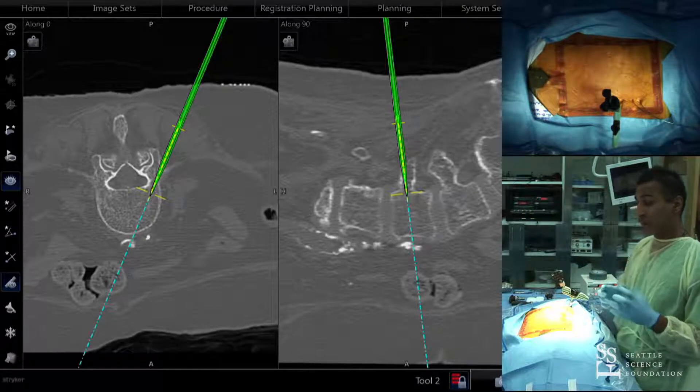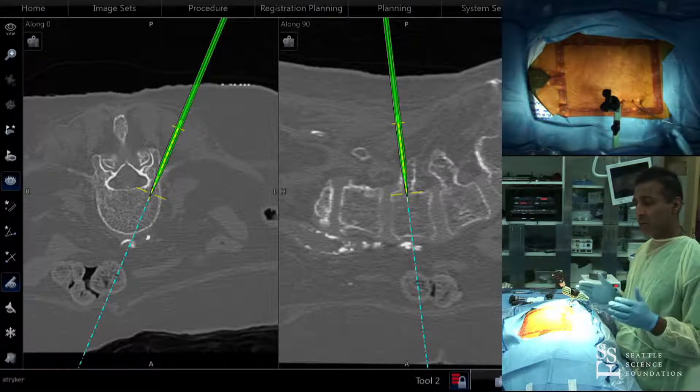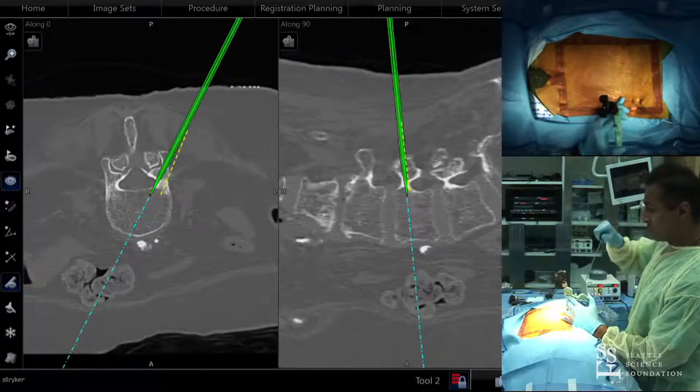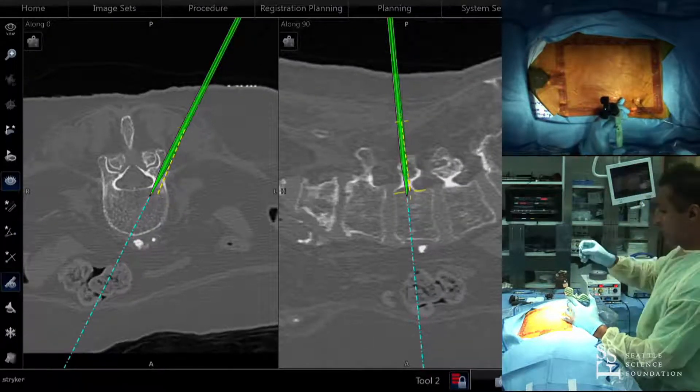I don't worry as much if you've done a lot of bony work and changed the relational anatomy — the picture can look concerning on the screen, but those are things you have to get comfortable with when you're navigating.